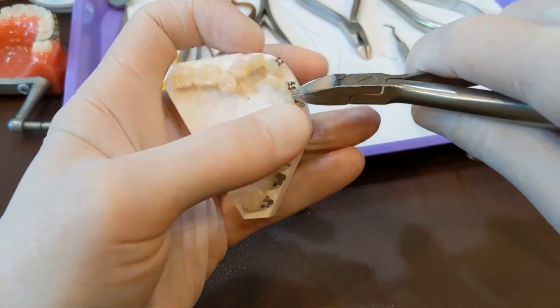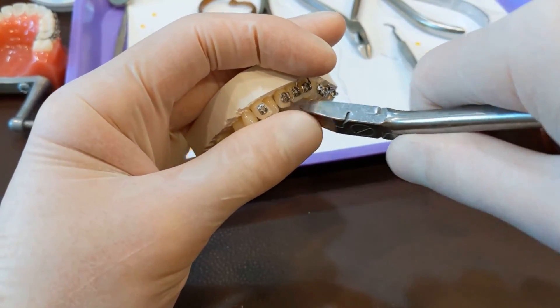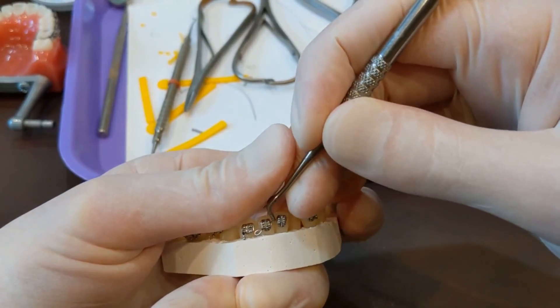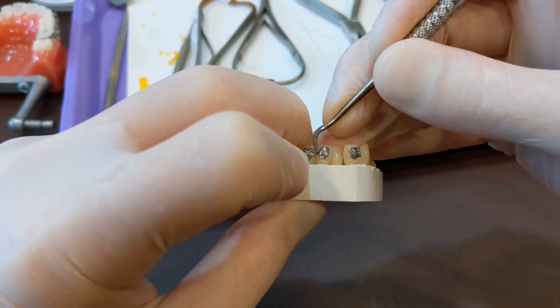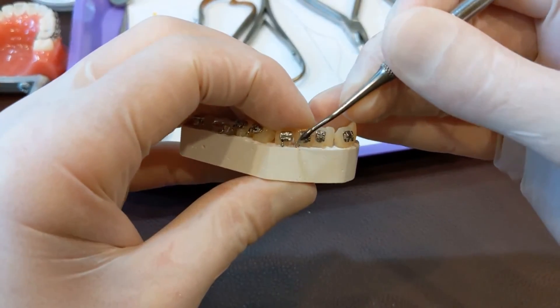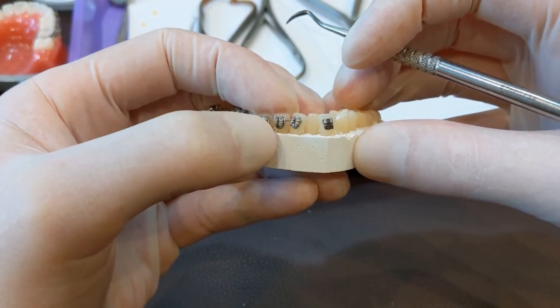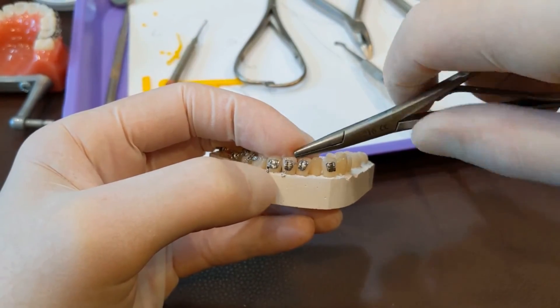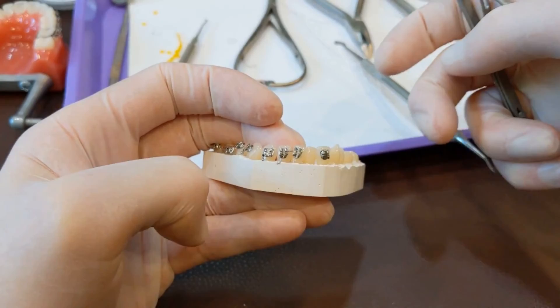Trim just a touch more and tuck it down nicely underneath where that wire is going to go. It can get a little wiggly when you go to tuck that in, which is why you want to get it really tight when you first get it down. If it gets a little loose — which often they do — you can get back in there, grab a hold of it, and just wind it up a little bit, like a half turn is all. If you turn it several times it can break the little steel. Get it nice and snug, tuck that down, and that's a Kobe tie or Kobe hook.